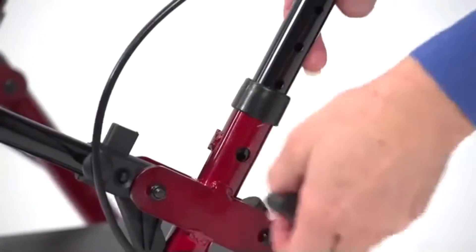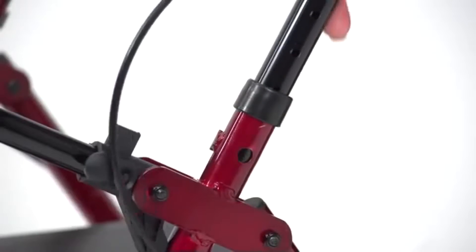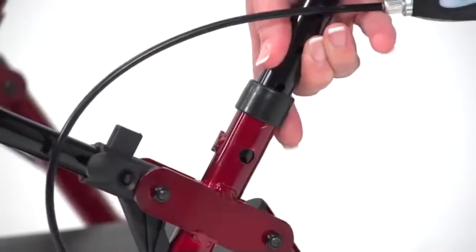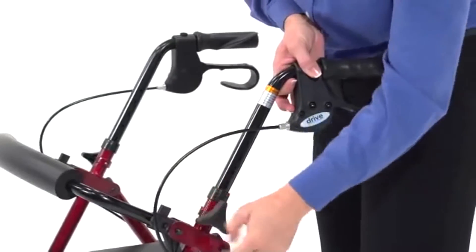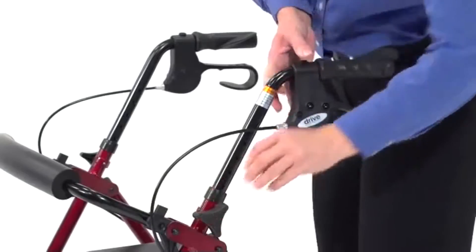For a confident, secure grip, the height of these ergonomic handles is adjustable. By unscrewing this knob, users can move the bar to select their desired handle height. Then they turn the knob in the opposite direction until it's tight and securely in place.